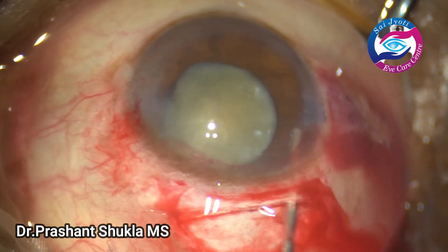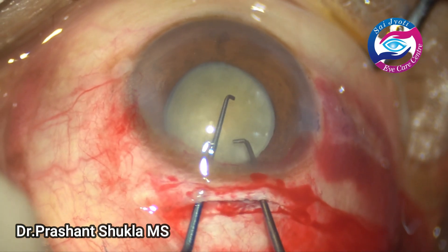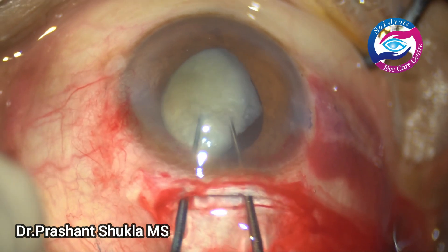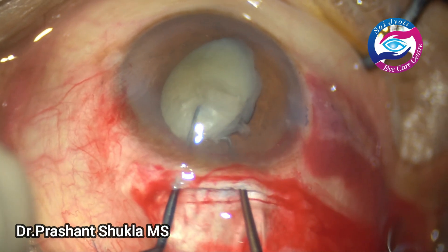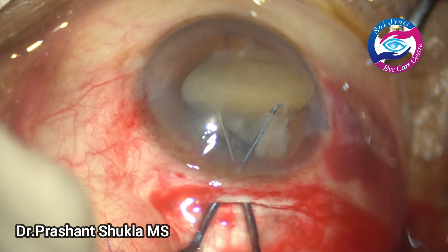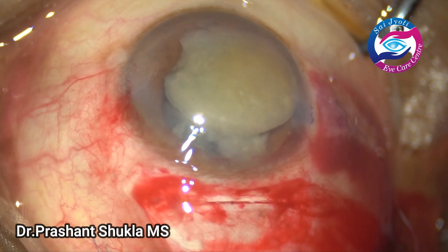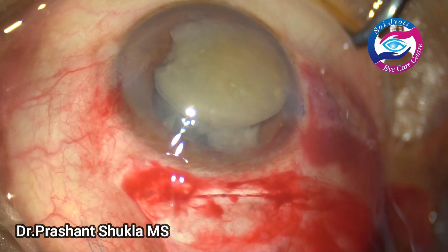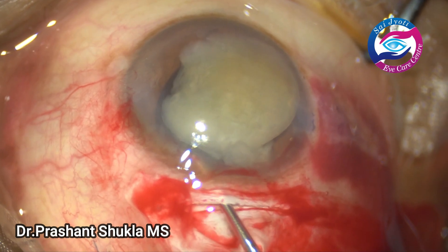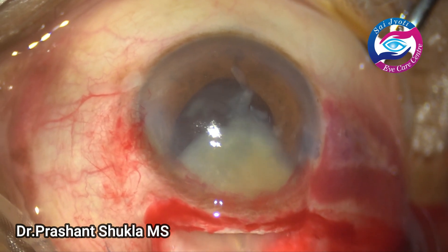Using a visco cannula I am checking the incision size. After putting some viscoelastic, two Sinskey hooks are taken and the nucleus is gently popped out and wheeled into the anterior chamber. Using viscoelastic again, I viscoexpress by pressing the posterior lip of the wound and the nucleus comes out.